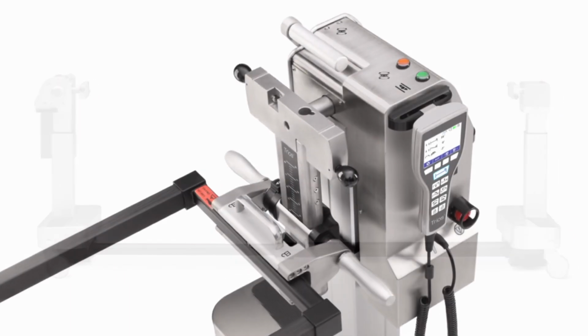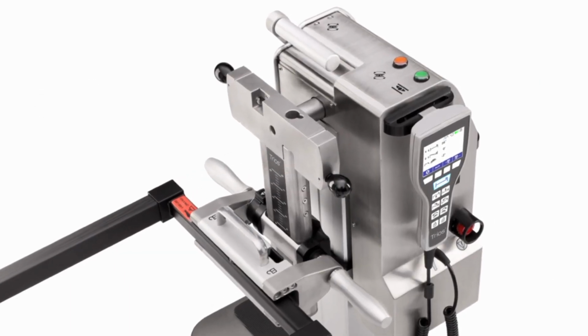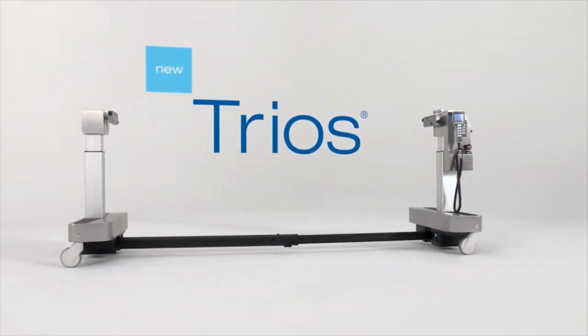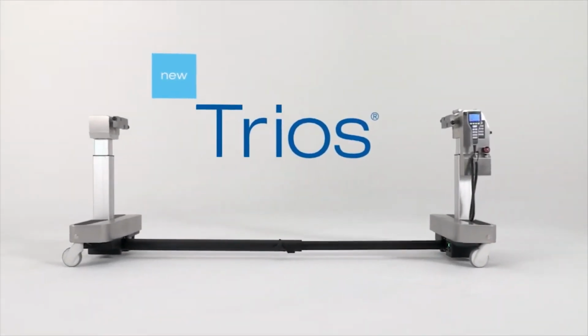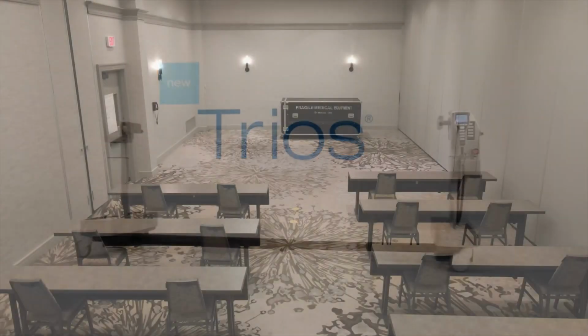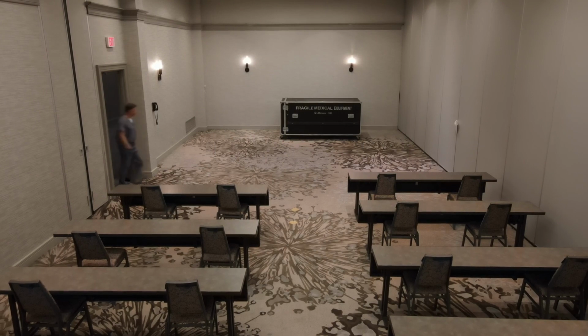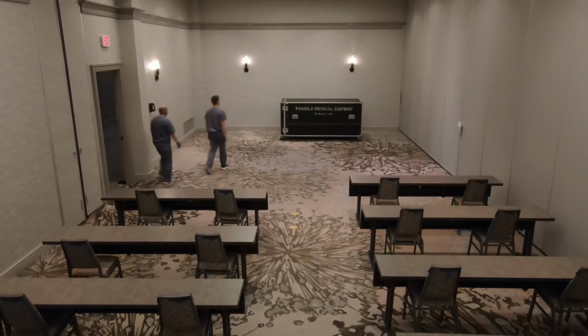Radiolucent Imaging Tabletop. FSI requires all partner agents and drivers to undergo this training prior to pickup or delivery of the Trios table. Make sure to find a large enough area to remove the table from the crate. It is recommended to have a two-person team to set up and break down the Trios table.